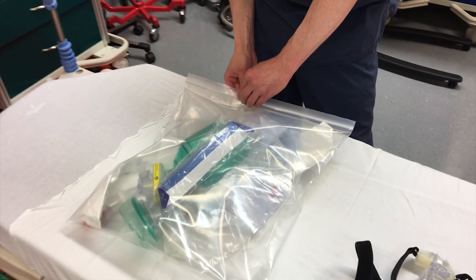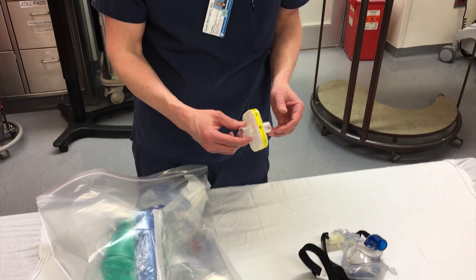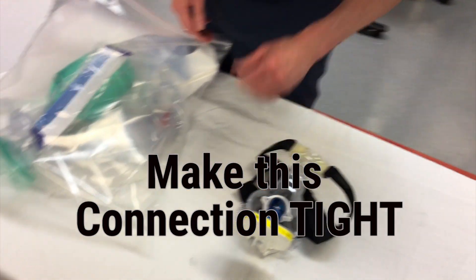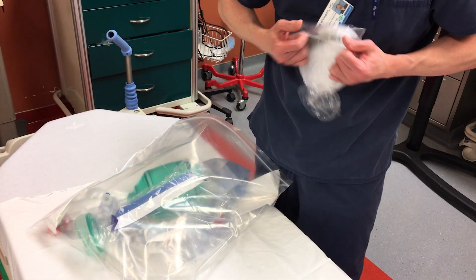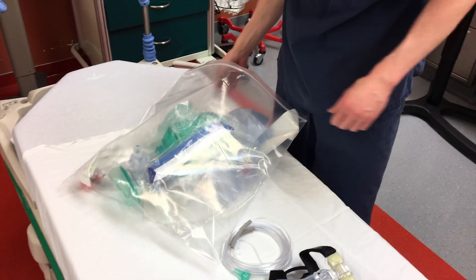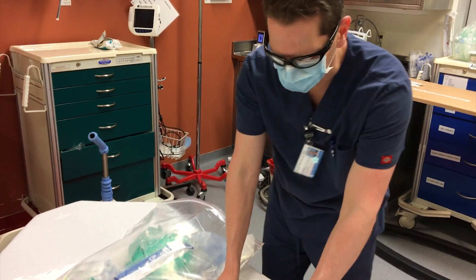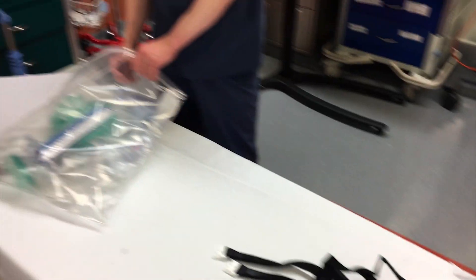Now what you're going to do outside the room, if you have a moment, is take your viral filter — it will be in a package; this one happens to be open for this demonstration — and attach it to the non-invasive mask. And you're going to get your nasal cannula out. You're going to do both of these things before you go into the room. We'll tell you in just a second why we're doing these things out before you go in.